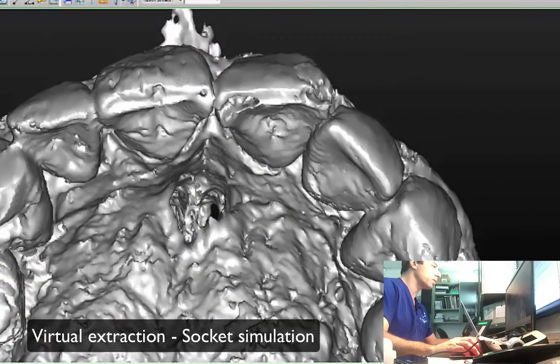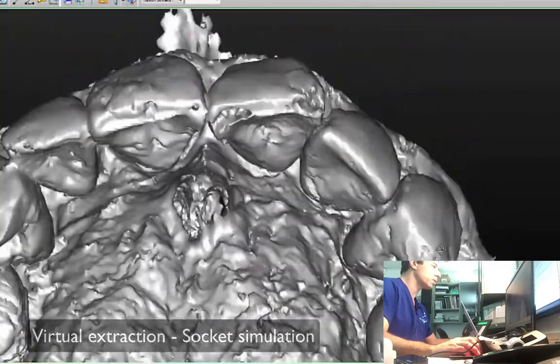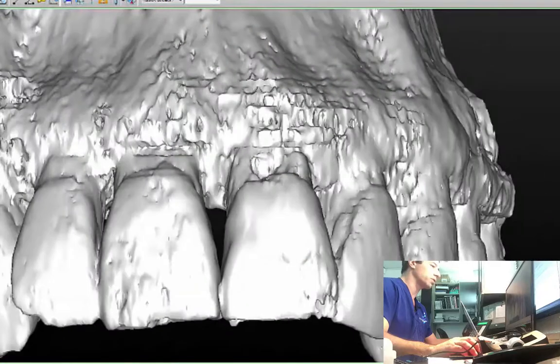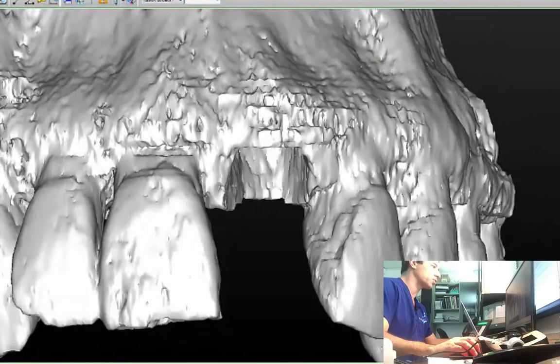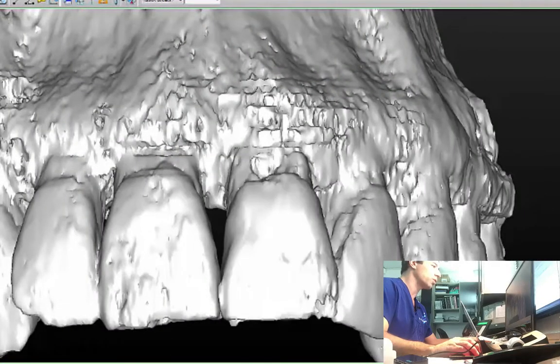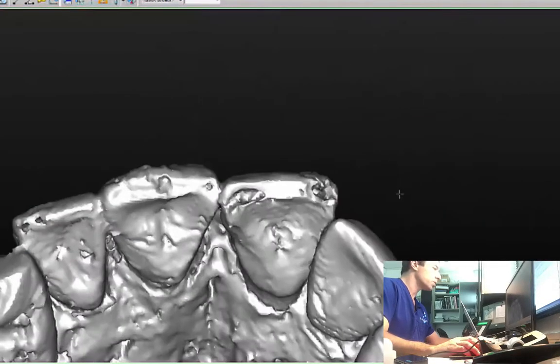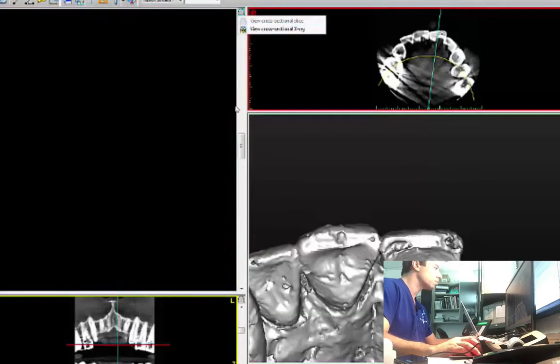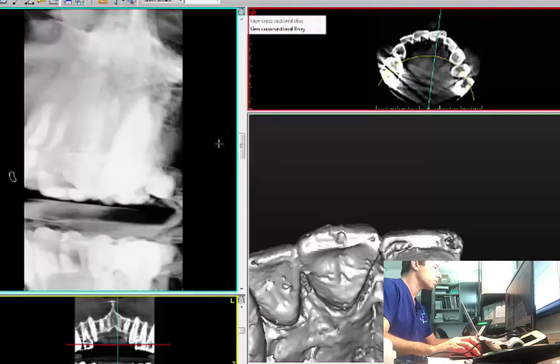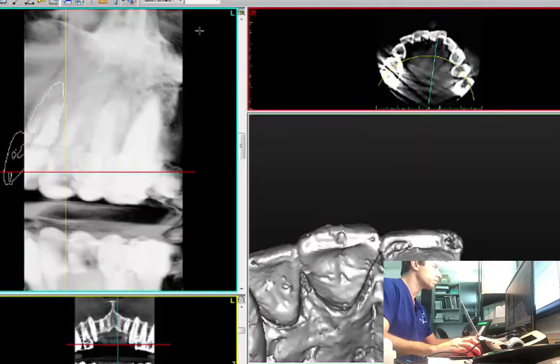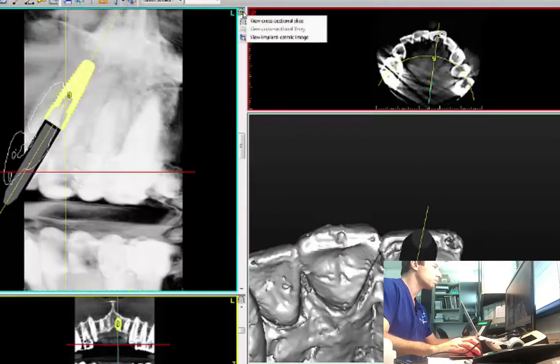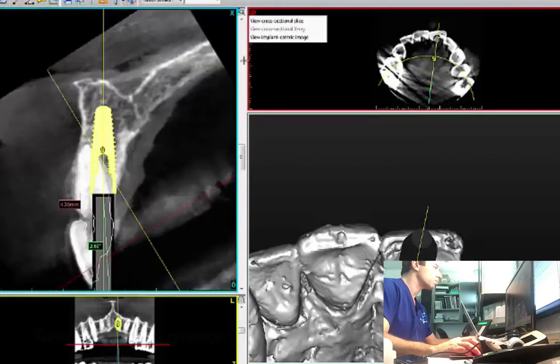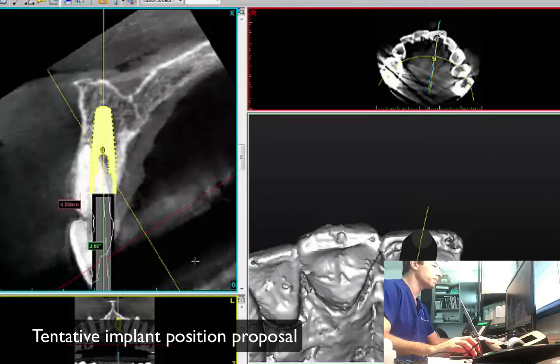We have the tooth and we have the tooth extracted virtually. Pretty cool. So here it is — we have the implant. Here's the position of the implant.